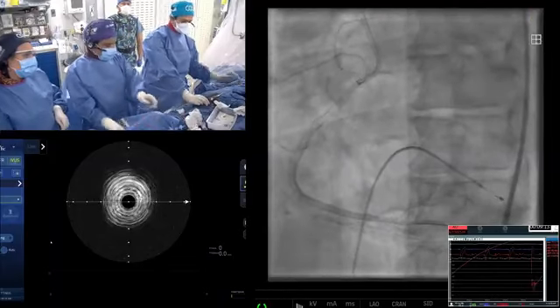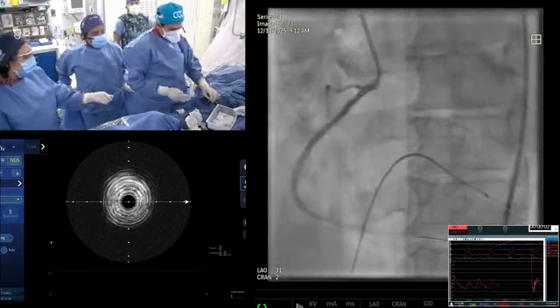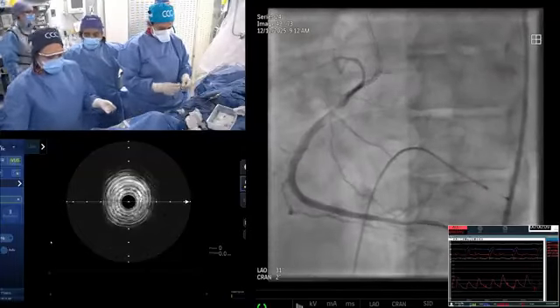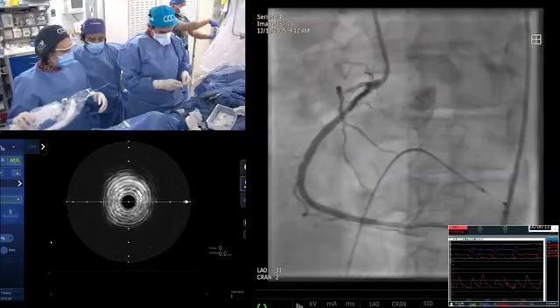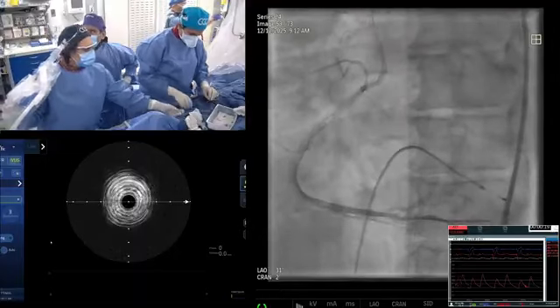It's great. Might need a little bit proximally, we'll see. Need another stent? No. Okay, doing good. Let's see the lumen. I know a lot of people said 5.5. So the question is, now what do you do? And that's basically the issue in terms of optimization. Like in this particular case, how can you optimize your lesion further?